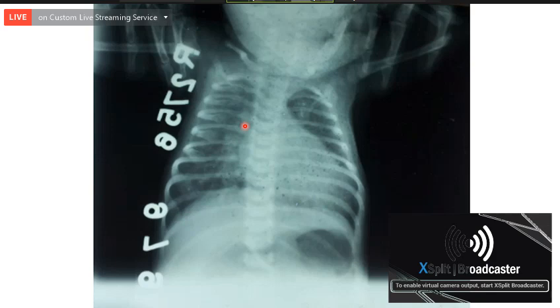So the absence of a thymus shadow usually indicates a very serious congenital heart disease, and the commonest condition where there can be a narrow pedicle and also an absent thymus is transposition of great arteries. Yes. So here this patient has egg-on-side vessels. You can see egg-on-side vessels, narrow pedicle, and significant cardiac enlargement. You can think of the possibility of transposition of great arteries.